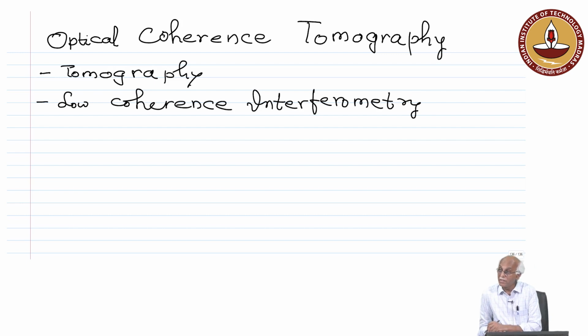What is interferometry? All of you must be knowing. And what is Michelson interferometry? You will be able to recollect. In that Michelson interferometer, what are we capturing? Do you remember? Phase information. As it is, phase information is difficult to achieve, but with the help of intensity variation it can be captured. And basically it also corresponds to the change in the path length, isn't it? That is what we capture. Can you recall?